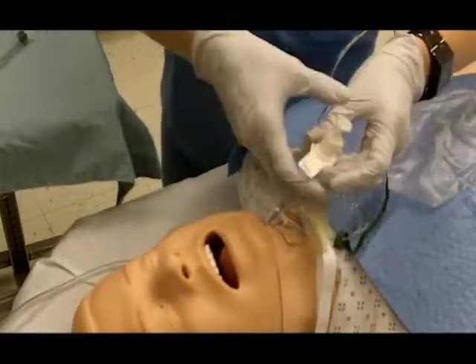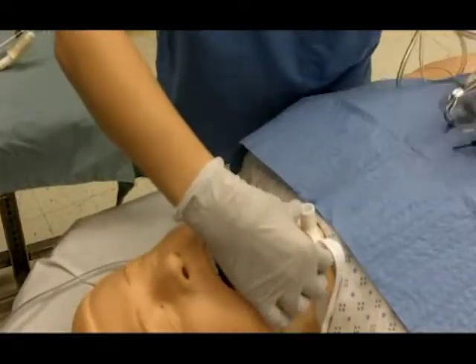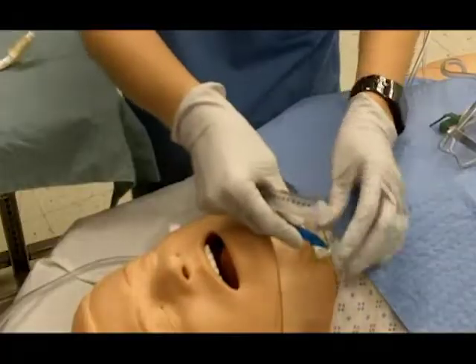Remove the old trach, ties, and sutures while stabilizing the intact tube. Deflate the cuff and suction the intact tube.